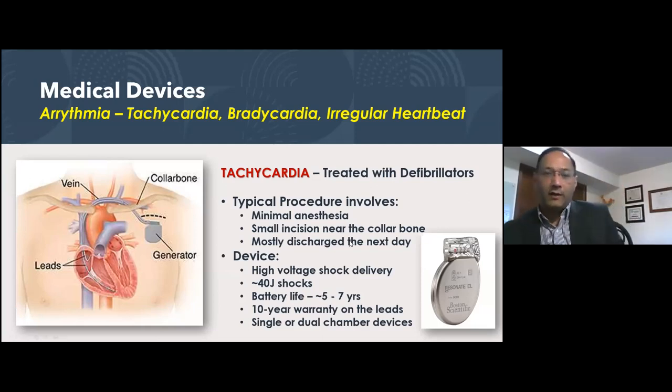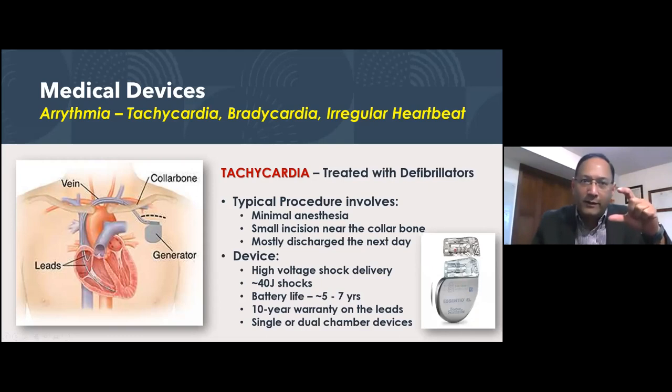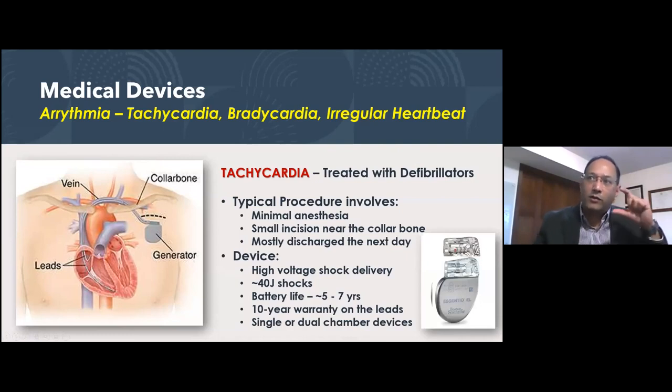So defibrillators are another pretty significant technology. Previously, these packages were very big and unmanageable. Now, just to compare with the pacemakers, the pacemaker that I showed in the previous slide, if you compare that with the defibrillator, only the header part is a little bit bigger. Other than that, it's almost as small. So these packages have gotten smaller and smaller and very manageable. Even on a lean person, especially women, you wouldn't even see a small structure. These devices have become really small.